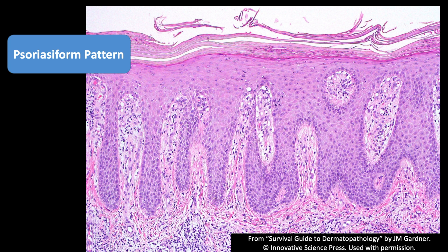In psoriasis, unless it's been previously treated with steroids — which can make it look unusual or non-classic — this is the classic example. The loss of the granular layer usually goes hand in hand with parakeratosis anywhere in dermatopathology, and that means the epidermis is growing too rapidly. It doesn't have time to develop a granular layer.